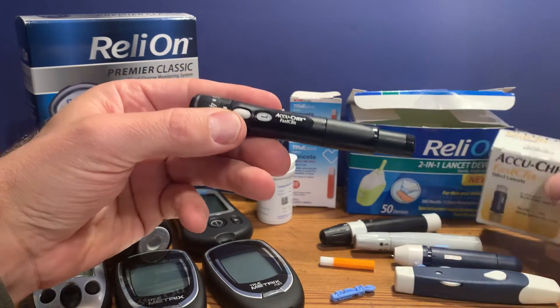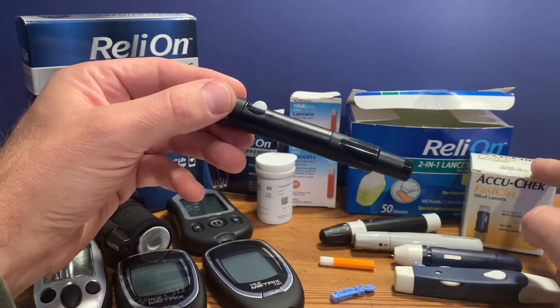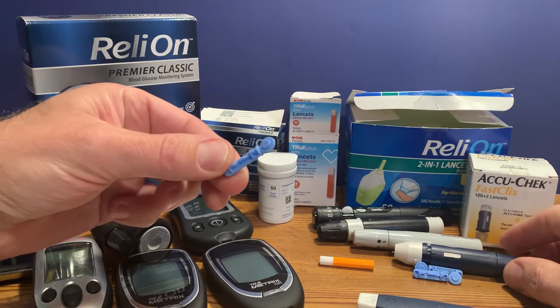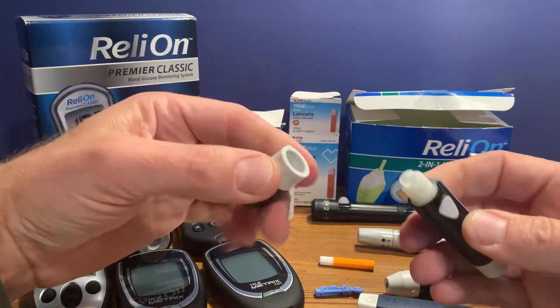With the AccuChek Fast Click, you can lance your finger six times before you need to replace the lancet cartridge. With these other lancet devices, you replace the lancet each time you use them. It's generally pretty simple.